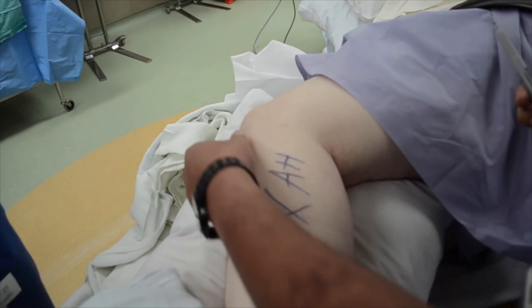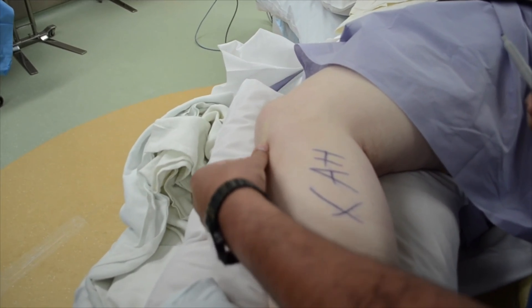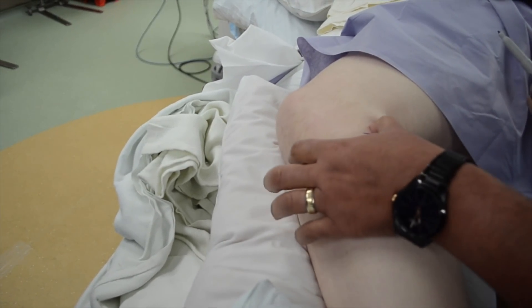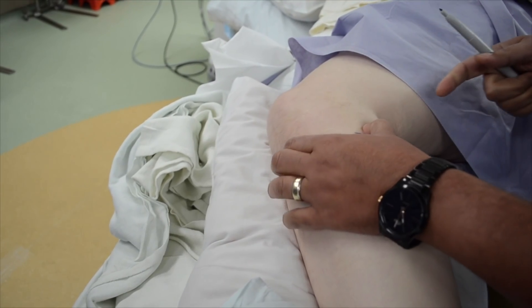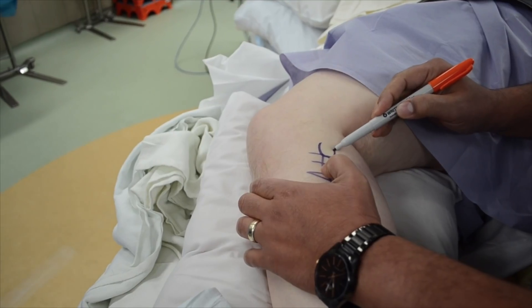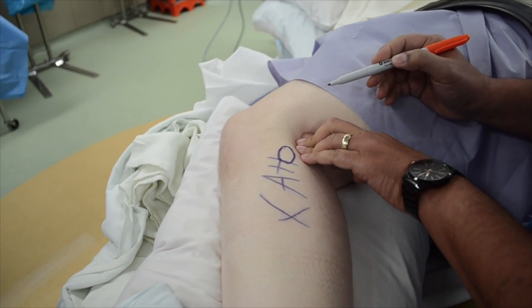To find the fibular head, follow the patellar tendon to the tibial tuberosity, and the fibular head will be in line with this structure. Here, the location of the fibular head as well as the tendon of the biceps femoris are marked.